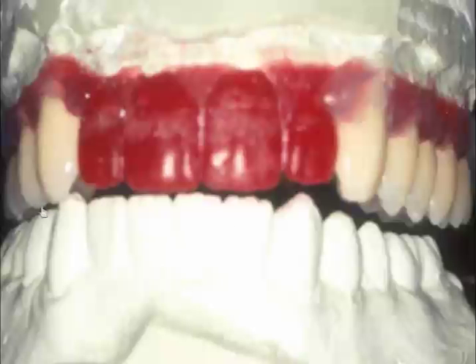And if that was ever to wear or break, the second bicuspid picks up. And if that was ever to wear or break, then the first molar would pick up. In other words, this patient will probably never have interferences the rest of their life. It's a great little exercise. I recommend you try it.